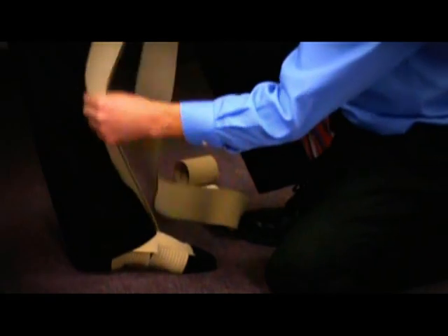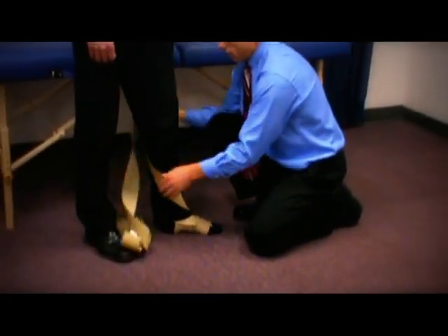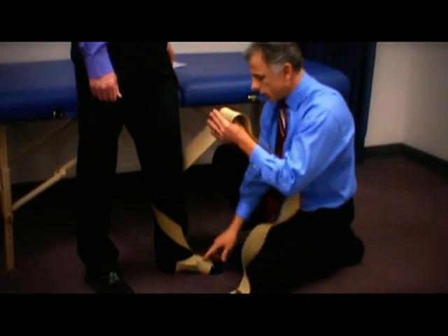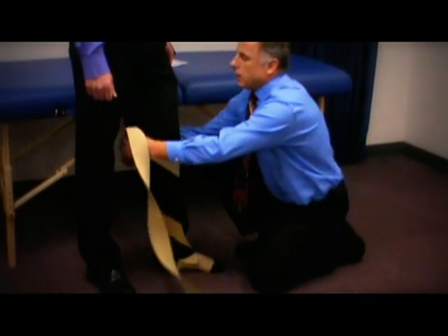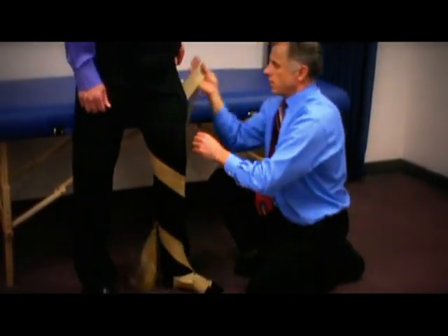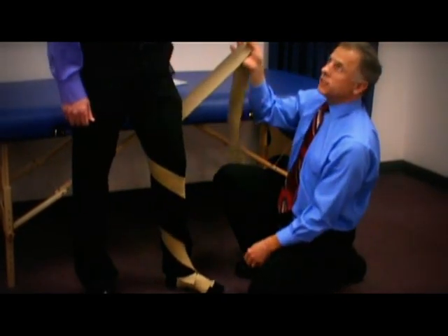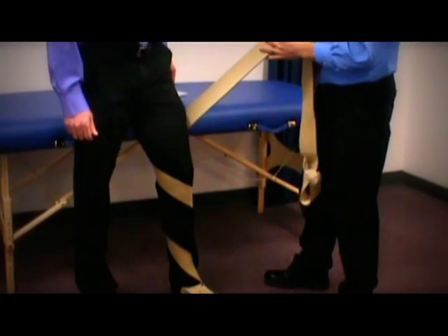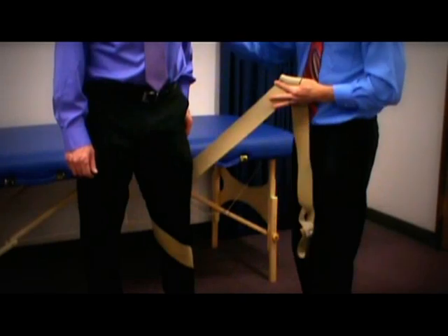So then we're going to come across the shin. This can be done over the pants, or it could be done under the pants too. But you got to put this on under the shoe, there's no doubt about that. Fits better and you don't have a slippery surface. As you can see, he's winding around. You got this nice and elastic, so you put it fairly snug. Now, why don't you take a step forward, Bob. If you got someone with an involved leg that's weak and they're unstable, obviously you're going to need two people to put this on to make sure there's no problem.